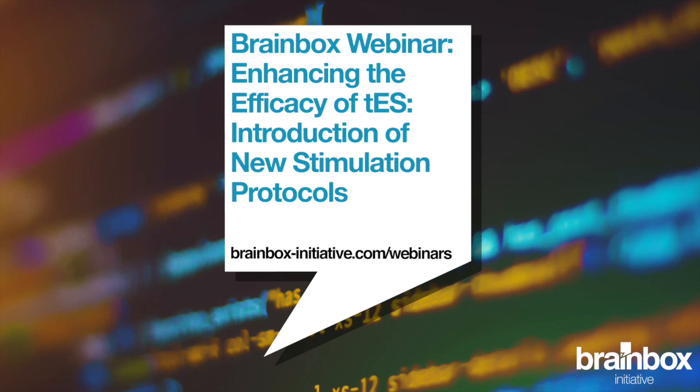So based on these TMS-EEG results, it doesn't sound this way, doesn't look this way, then this makes things much easier. But in general, and I think that's also an important point for all these neuromodulatory techniques: if you want to change excitability, if you want to induce plasticity, it always depends on brain state, and always has some options for non-linearities of effects.